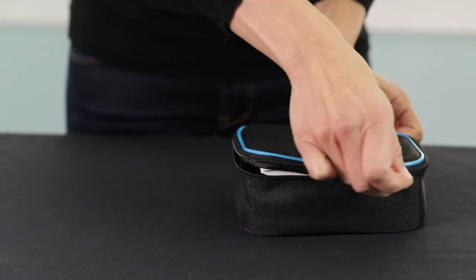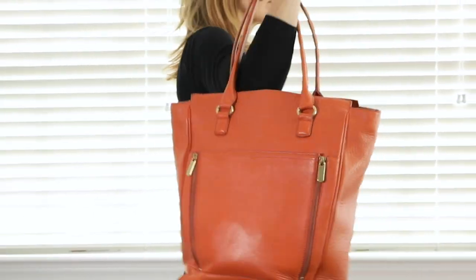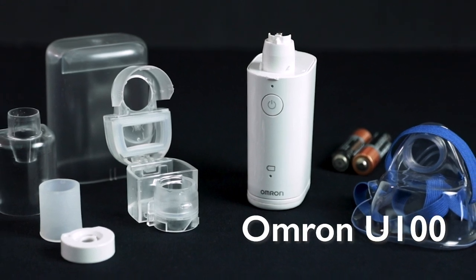All of these products are extremely quiet and pretty fast. They are intended for on-the-go use and can all fit in a handbag or purse.